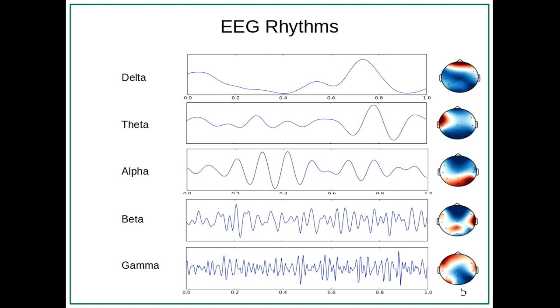And what researchers are looking at is, with these different kinds of waves, how much of these waves are present in the signal. What is also looked at is where inside this wave you are currently at. Are you at the top or at the bottom of this wave? What people are also looking at is a common wave between different electrode sites. These are all interesting properties to look at if you're investigating the brain.